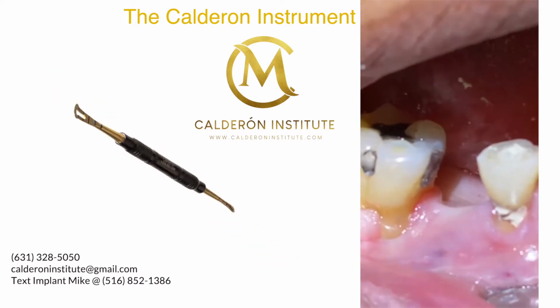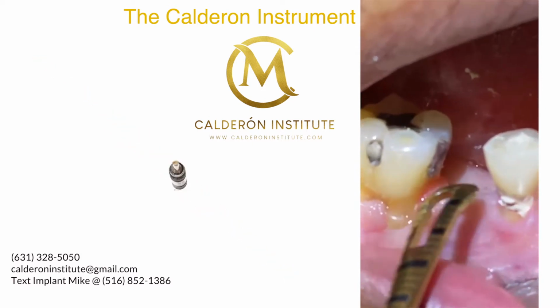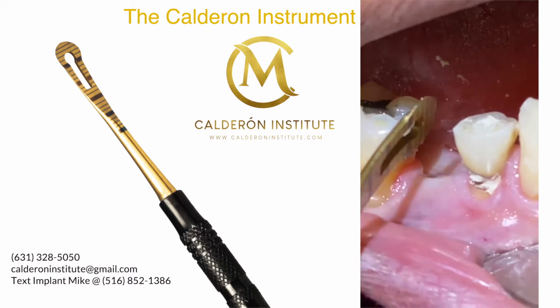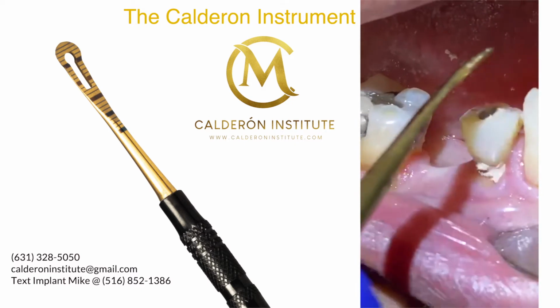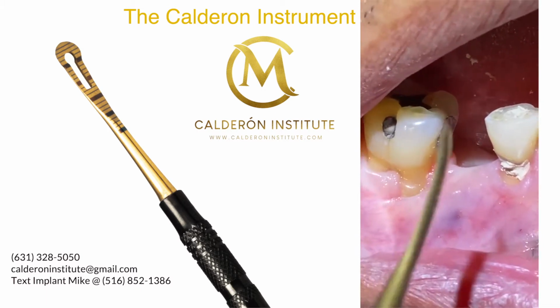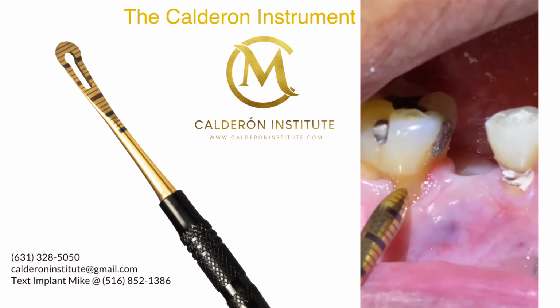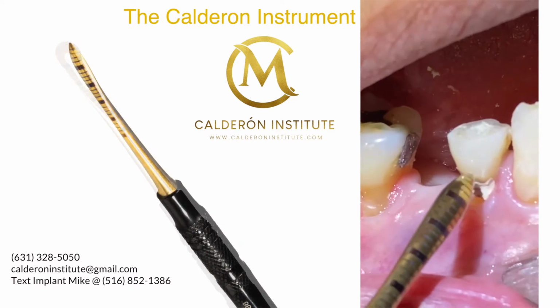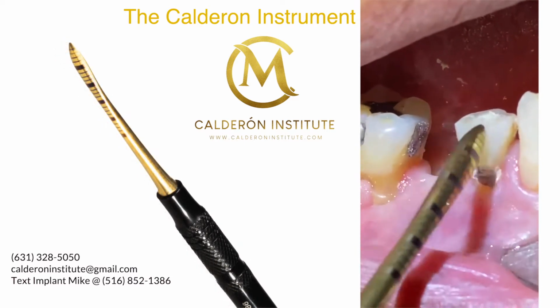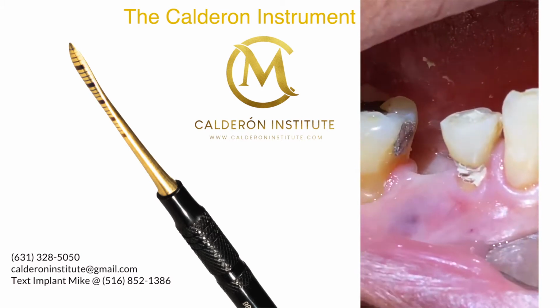Yep. Good. So once again, we're here with the Calderón Instrument, and we want to know distance here. Most people are told that they need a surgical guide here to place an implant. We already know where the root obviously is. Yes, we're going to do a little tissue graft here later on. And here, this just got a root canal done, so now we're going to let that heal. And when we do the crown here, we'll do the implant crown here.